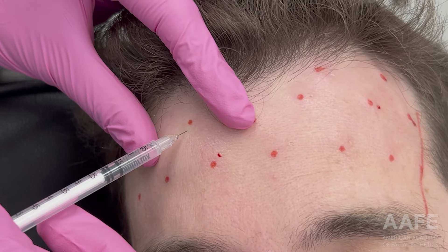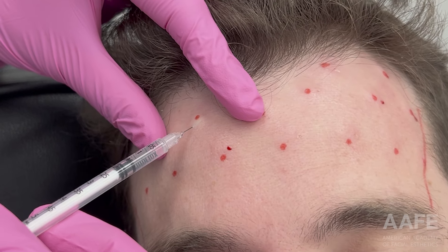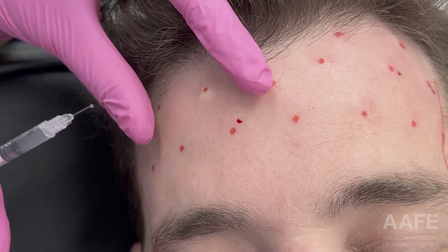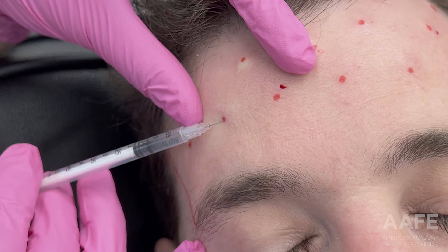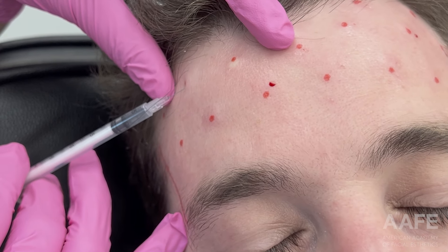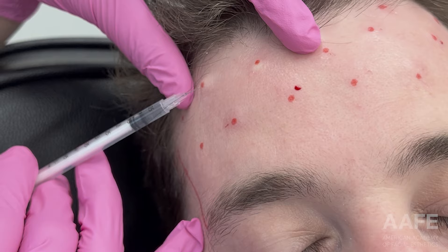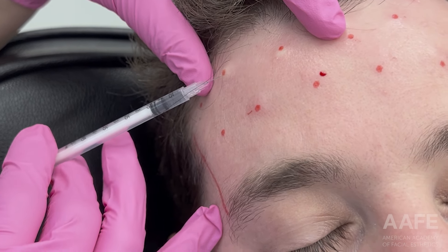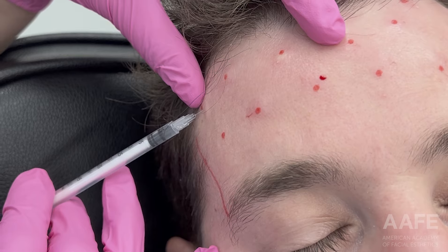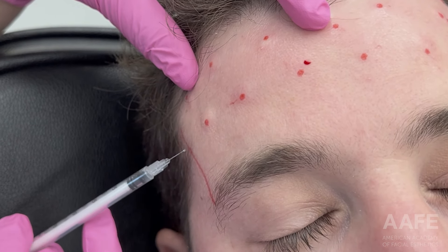Keep in mind that men typically require a higher dose with tox — they have stronger muscles. When dosing a male patient, you should assess the strength of those muscles and adjust accordingly. A woman and a man's dose is never going to be the same. As I reach the other lateral border, I'm injecting close to it — like I said, I don't want any spocking of the brow, so I'm treating all the way to that lateral border.